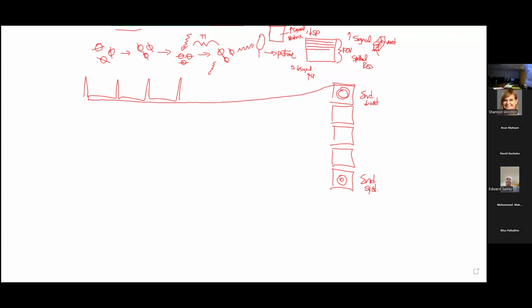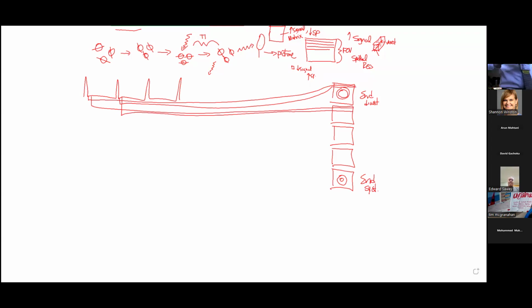We made the line in this interval of time, and then this part of time goes over and makes this one, and we work through all of that. Remember? And so we had to be able to trigger.